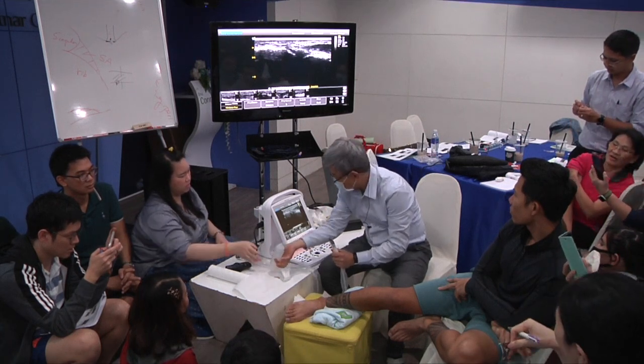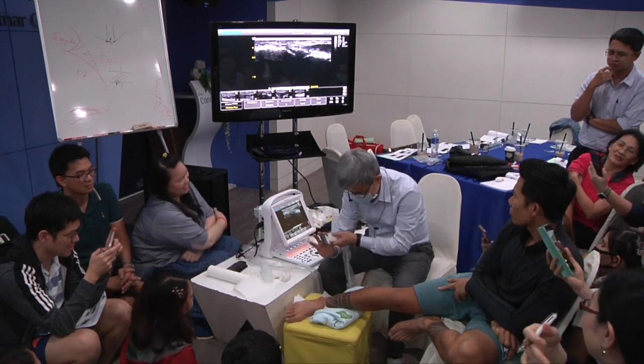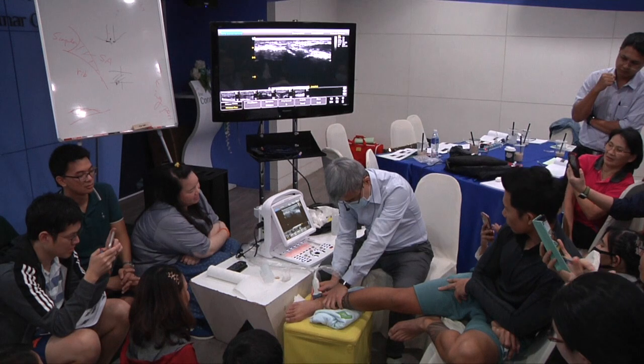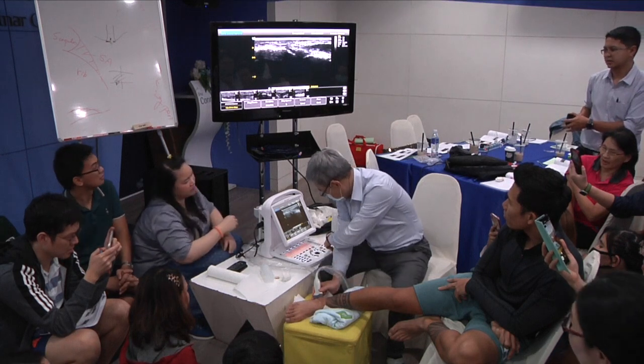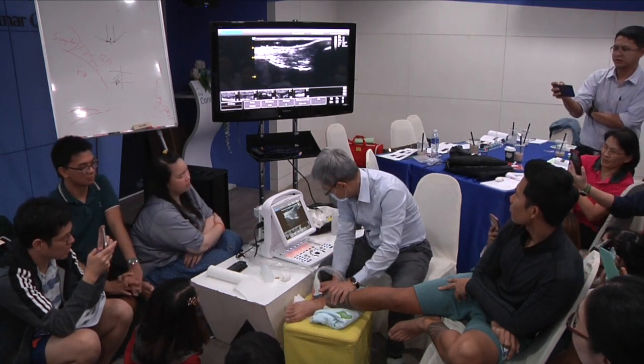So we are thinking about the same scale, so you know what I mean. Then slightly posterior. Then freeze. Okay.